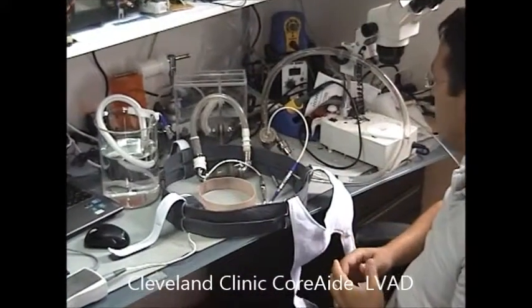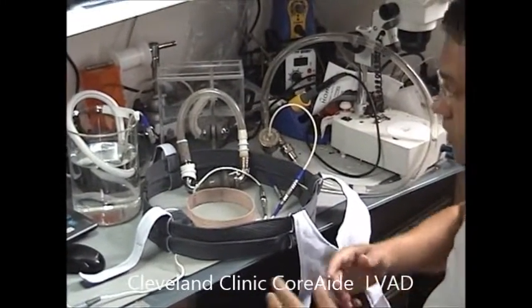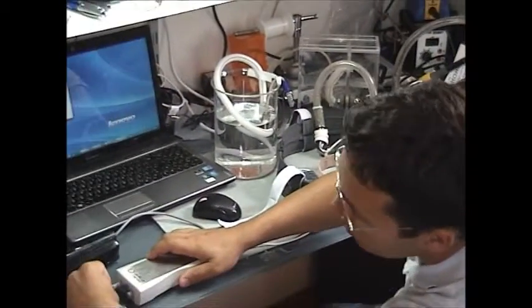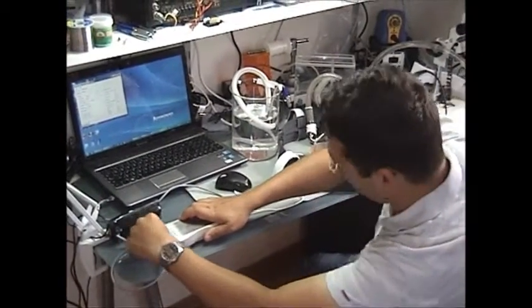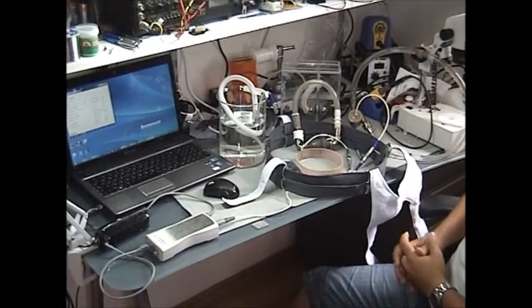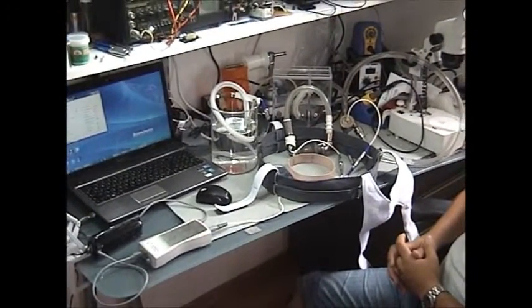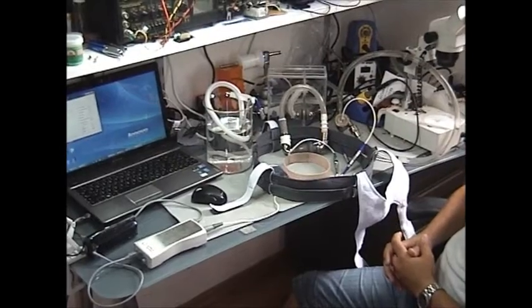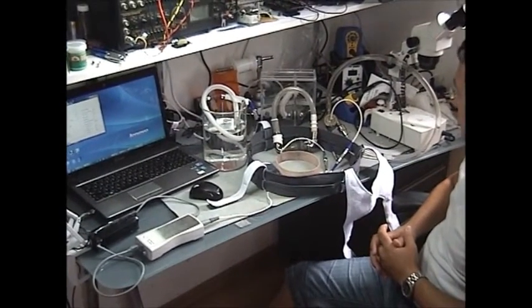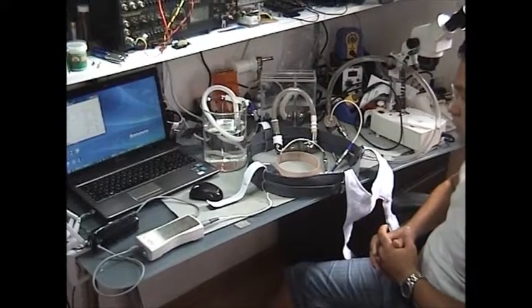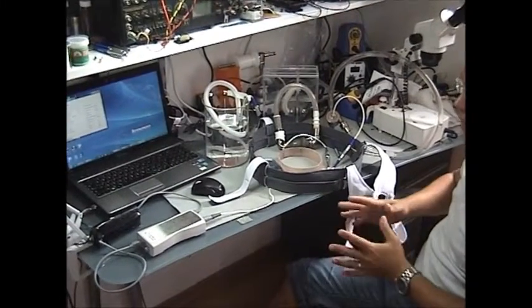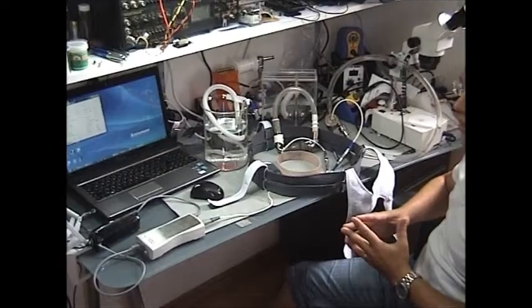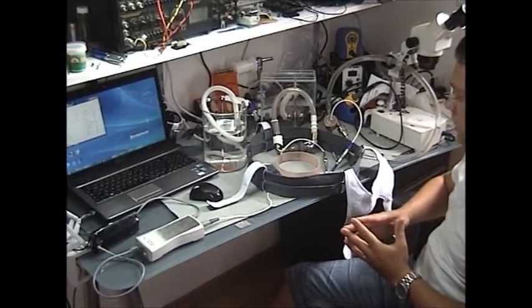You can see the VAD start to operate and the external controller. Right now we hear the sound that means that the external controller has been synchronized.